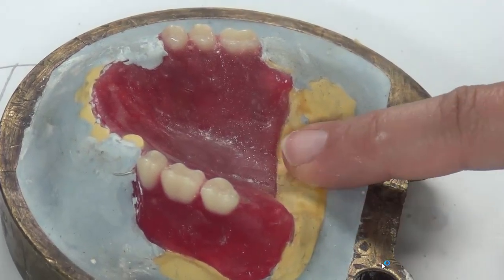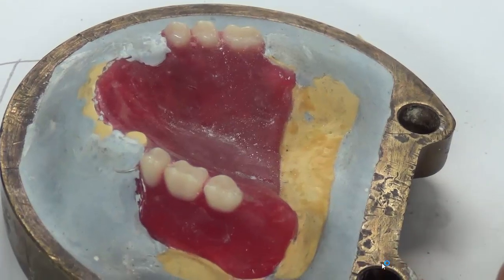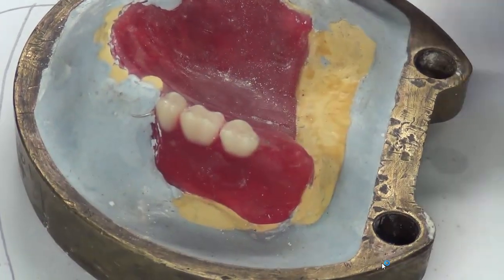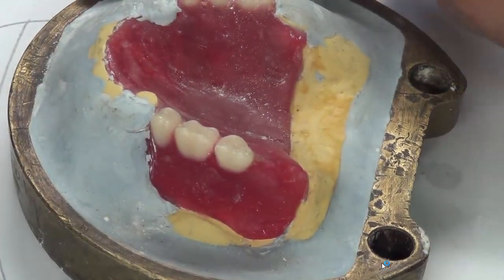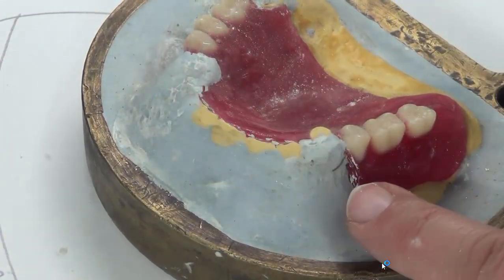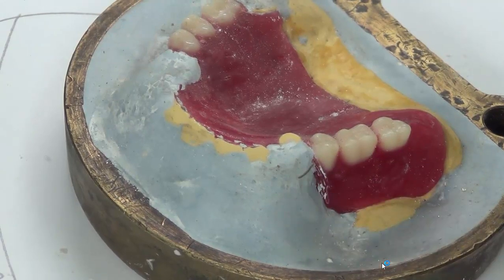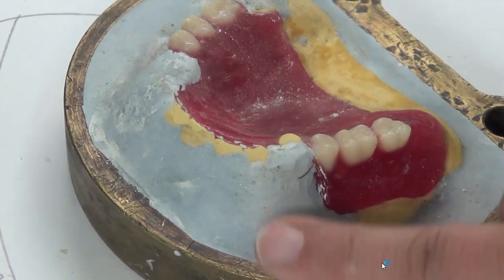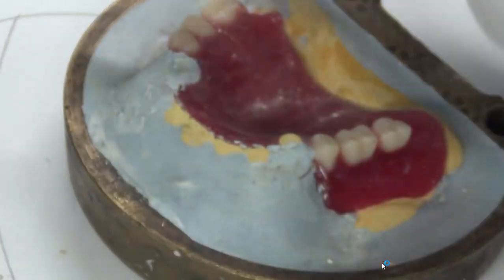So plaster is added in between the cast and the land area and the rim of the flask, okay? It's continuous, it's smooth, the rims are clean. We have covered all the teeth, the natural teeth we have cut. The wires are embedded inside the plaster. We don't see the wires through. We don't have any undercut around.